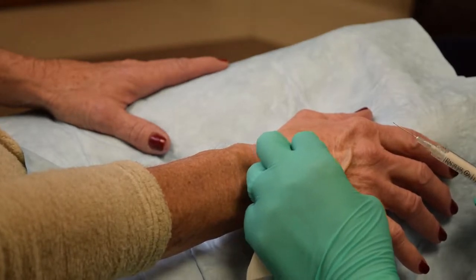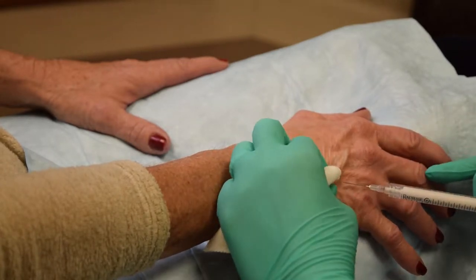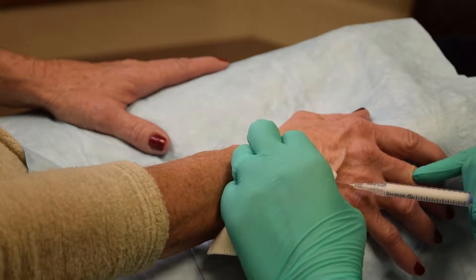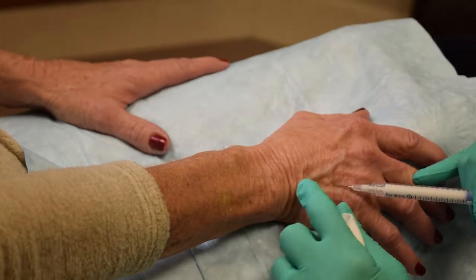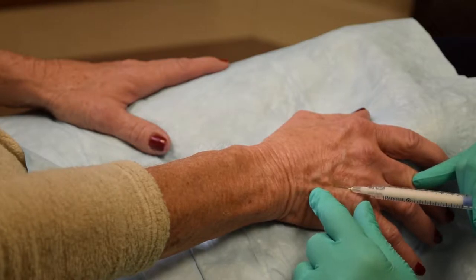I tent the skin to make sure that I deliver the product superficially enough to avoid puncturing a tendon or embolizing a vessel. It is important to undercorrect, as down the road the product will result in additional collagen formation and you really don't want to have puffy hands.